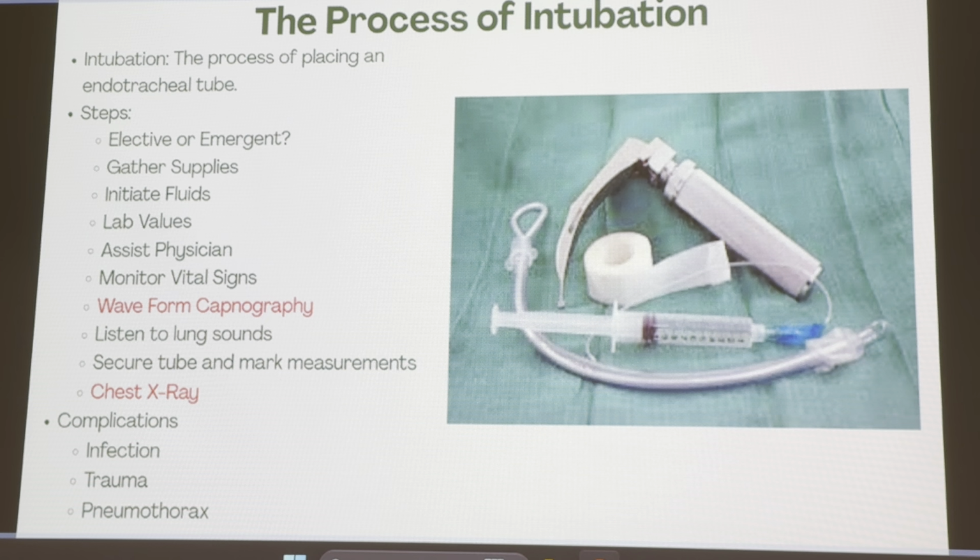So as you're listening to those lung sounds, as that physician or respiratory therapist is delivering those breaths with an ambu bag, or they've already connected them to the ventilator, we're only going to hear lung sounds on the right side. Hopefully, the physician has not left the room. He shouldn't, because we haven't confirmed placement, but he'll be able to pull it back out a little bit until we hear lung sounds on the left side and the right side. Does that make sense?